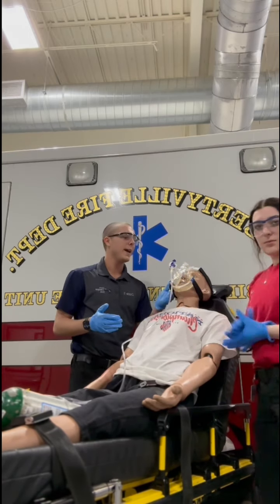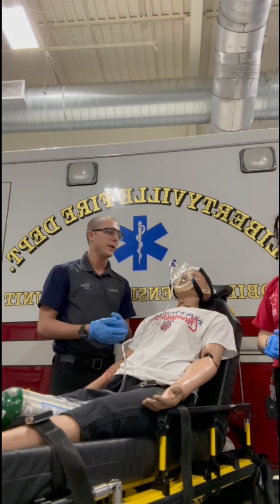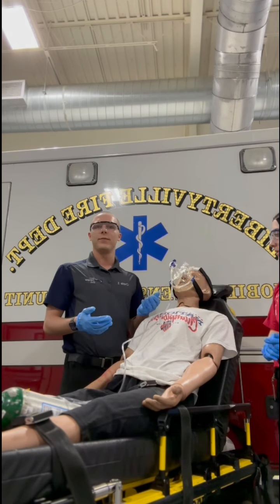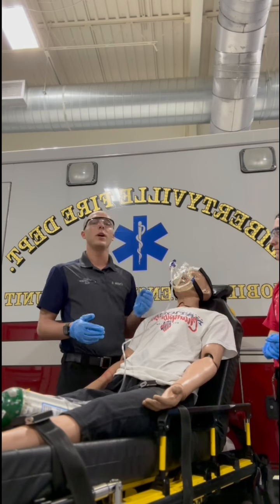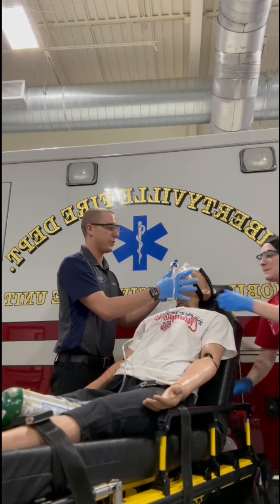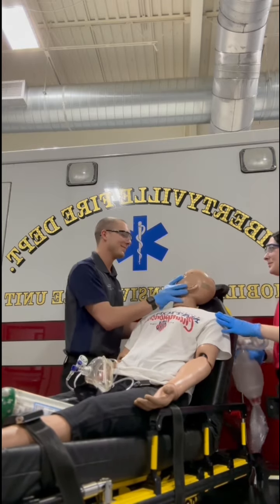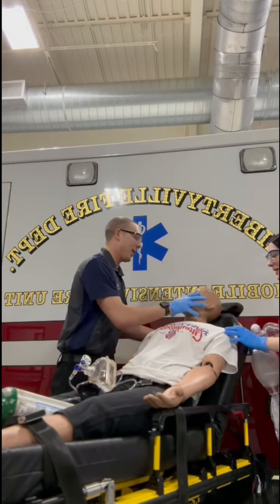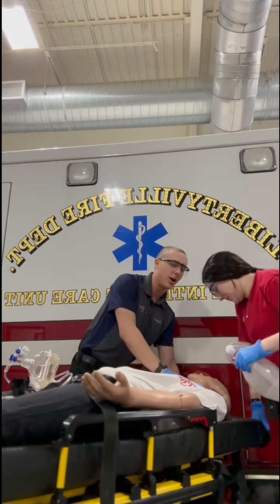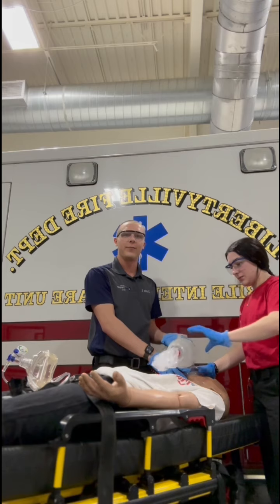When the mask is on the patient, we're going to keep coaching them through it, telling them to breathe in deeply, and asking them if it's comfortable. If it's not comfortable, or if the patient decompensates, we're going to remove the mask. So there's 2 clips, they come off pretty quick. We're removing that mask. And then they're decompensating, no longer can maintain their own airway. We can use alternative solutions like a bag valve mask here.